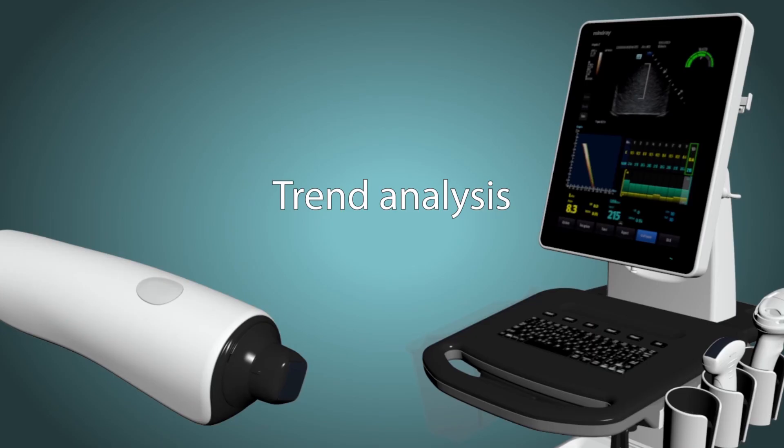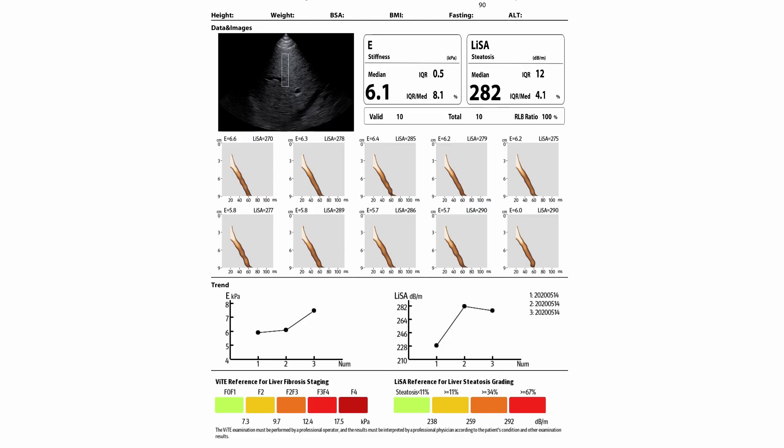The next step brings us to the trend analysis section. Trend analysis is made possible as patients will receive multiple exams over time, and the measurement trends from all exams will indicate the progress of the liver disease.